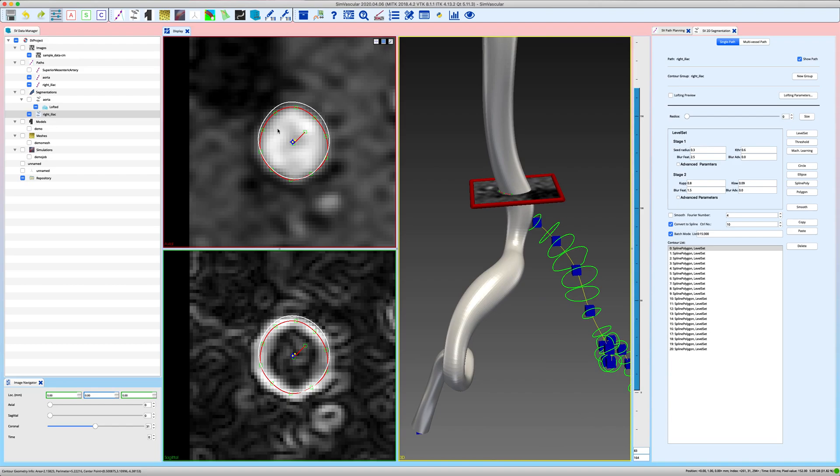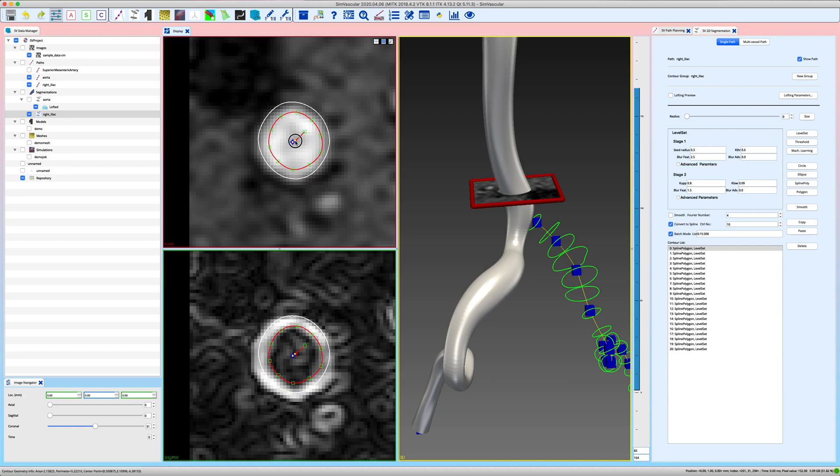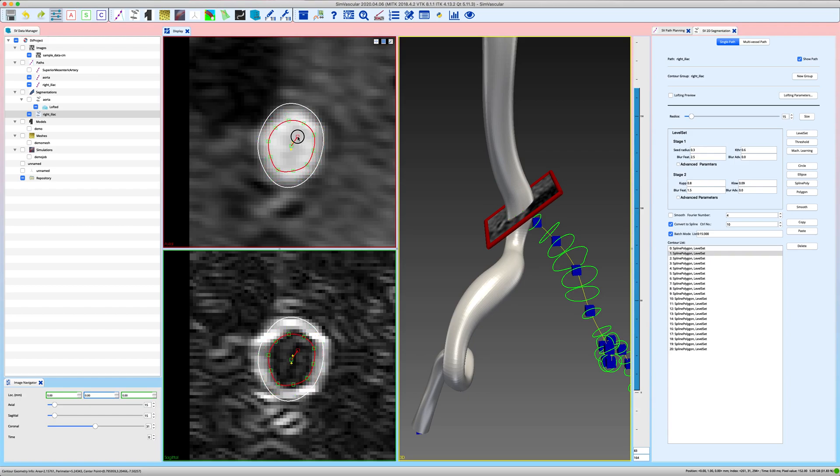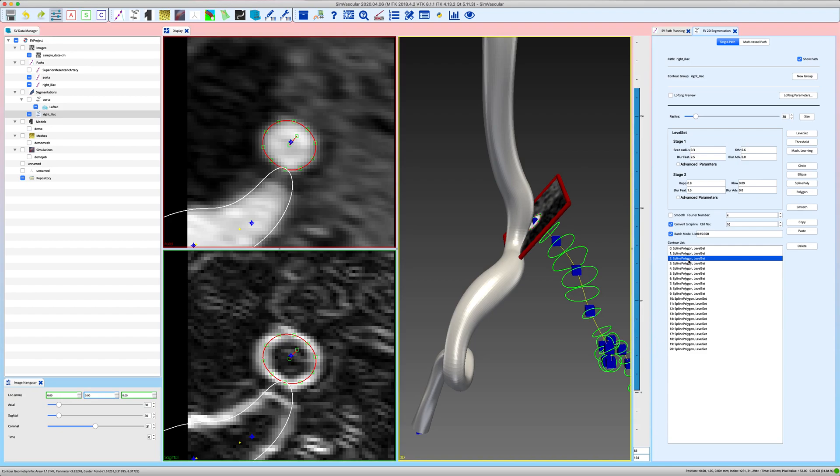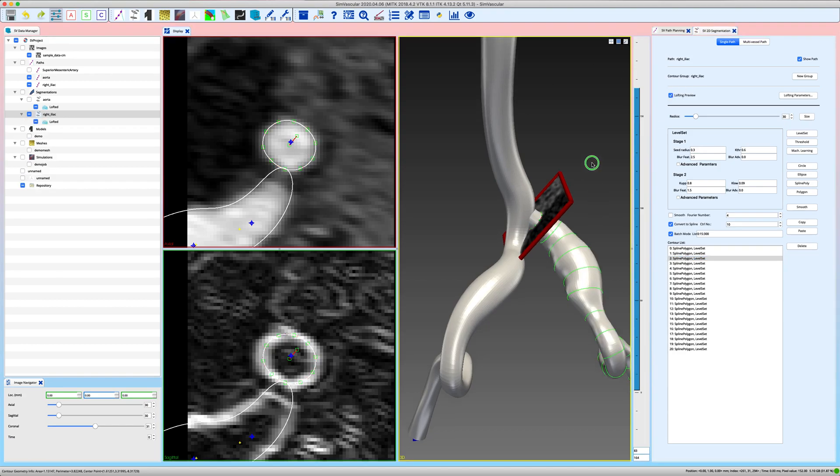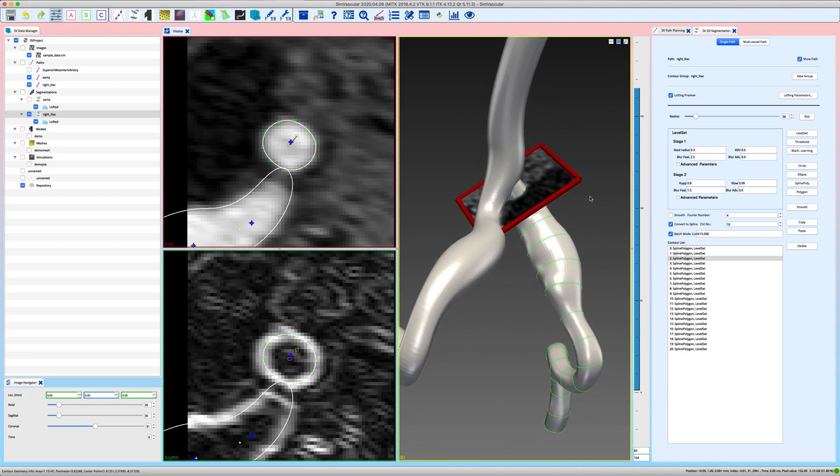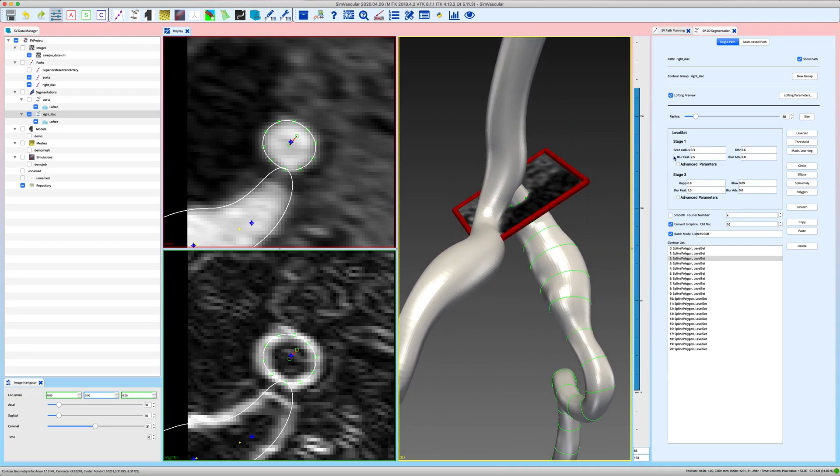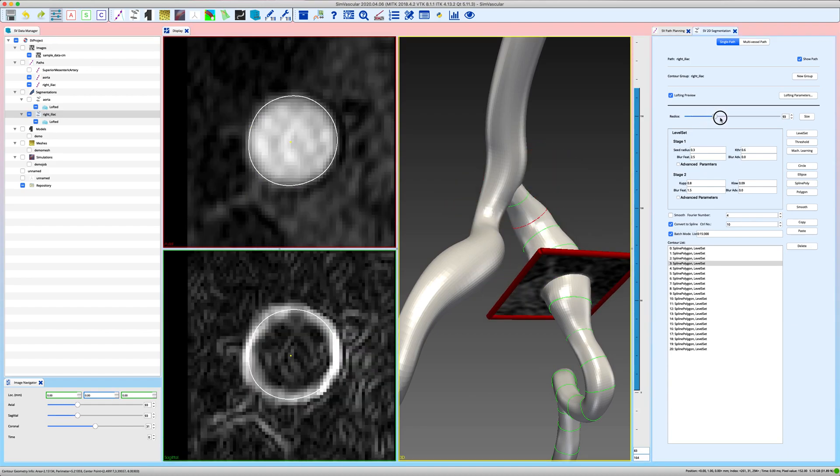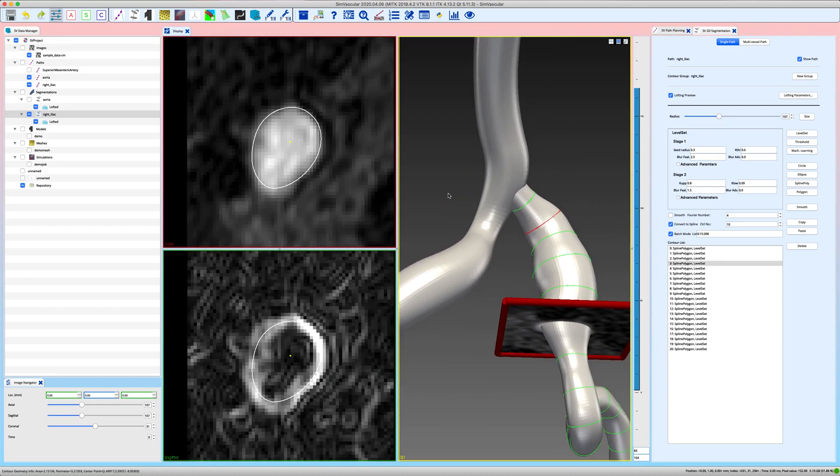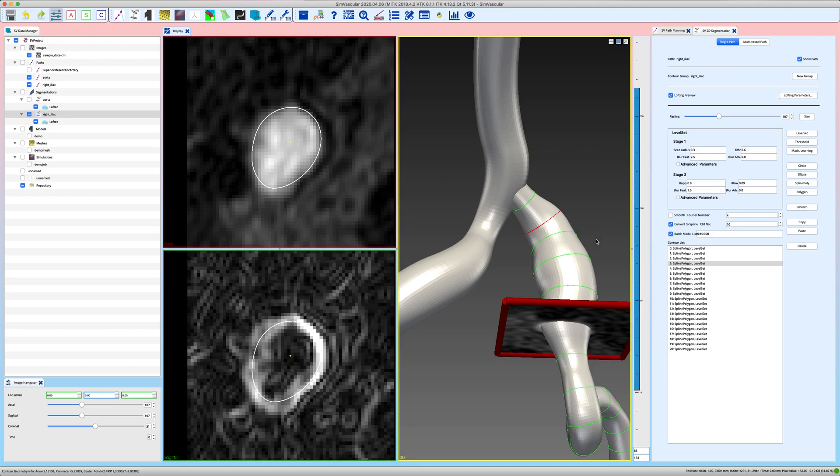Since this vessel and the lofted aorta should join and create a coherent model, what you want to have is that your initial segmentations are completely inside of the vessel that they are branching off from. So that's why I'm reducing the size of this first level set even though the actual vessel outline is bigger. I'm doing the same with the second one because it's still 100 percent inside the other branch that we segmented. Okay but here we are already in the right iliac so let's see how the lofting is doing.